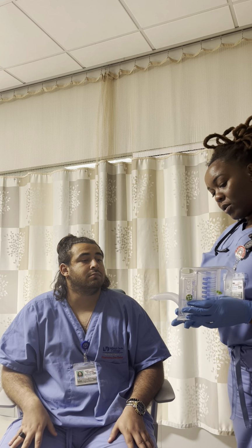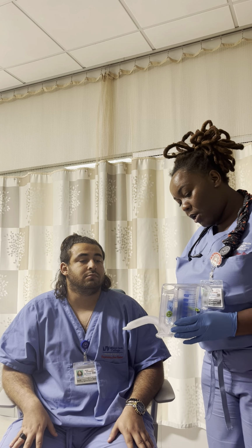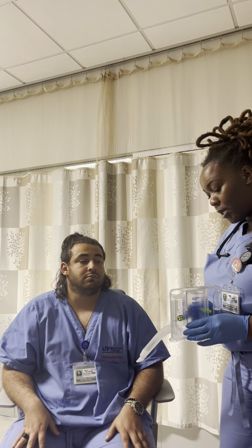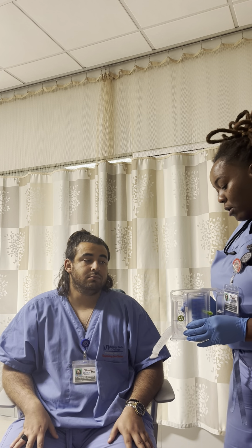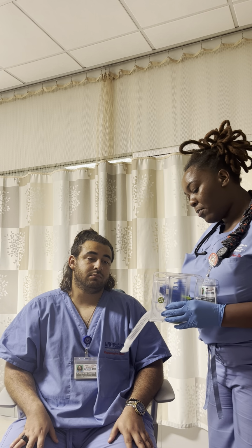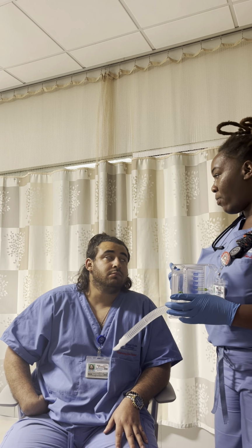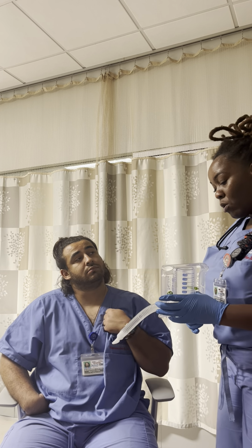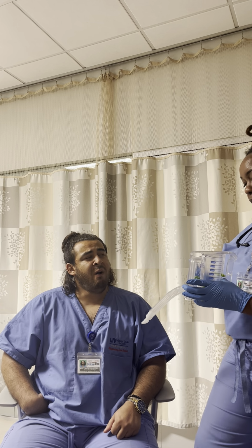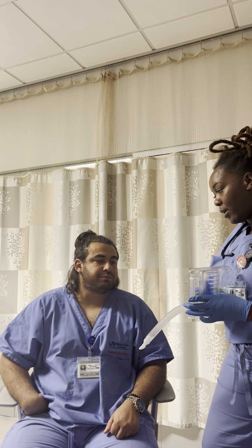All right, so here we have the volume, which is set. You have your mouthpiece, and you have this little green piston. That green little piston is going to go up here to the smiley face. You want to try to keep it between the two arrows in that smiley face, okay? That's how you know you're inhaling properly at a good flow, because it's going to be slow breaths. Slow, deep inhalations, okay? Once you get up here to this green, you're going to hold it, okay?